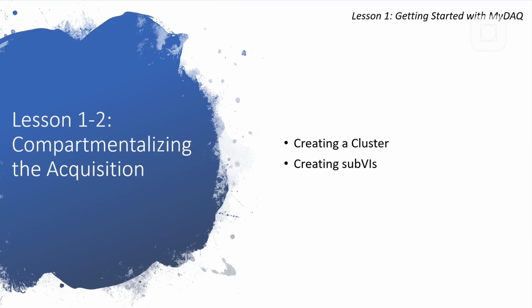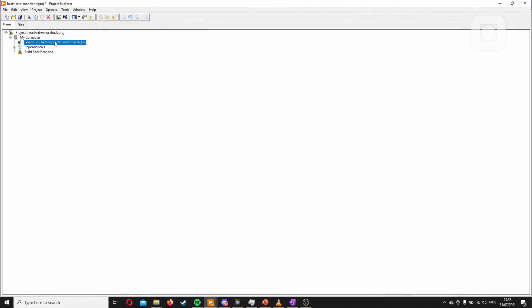This is because we will use it later, and a compartmentalized version of this will be much easier to use. It will be more orderly too. We'll start by making a copy of this one. We don't want to overwrite it, as this is a very basic MyDAQ reading. So if you ever have troubles, like it doesn't work or anything, you could just start this VI, and you know it works. If it worked in the last lesson, it works and there's nothing fancy in it. You can see every part of it, so it will be easy to debug.